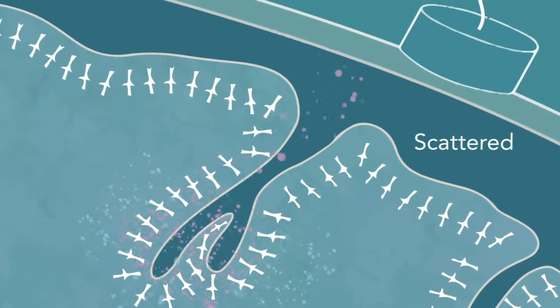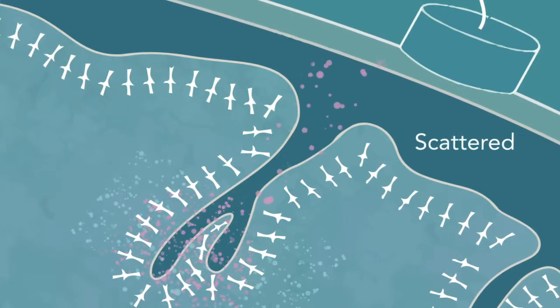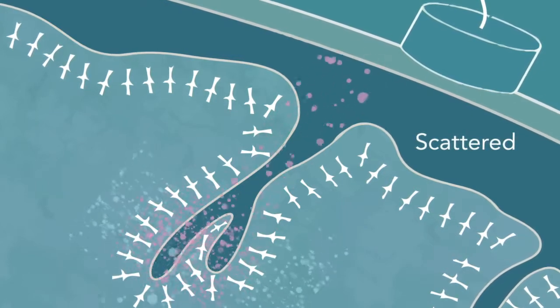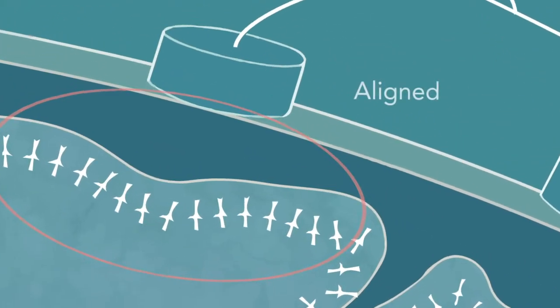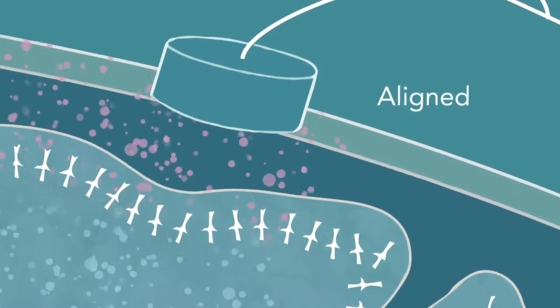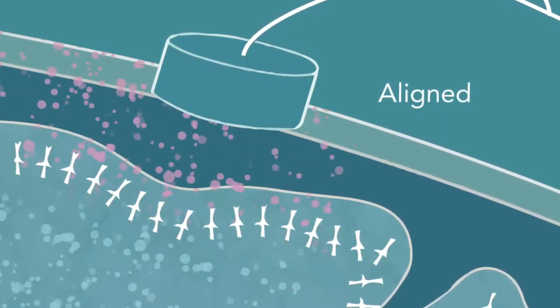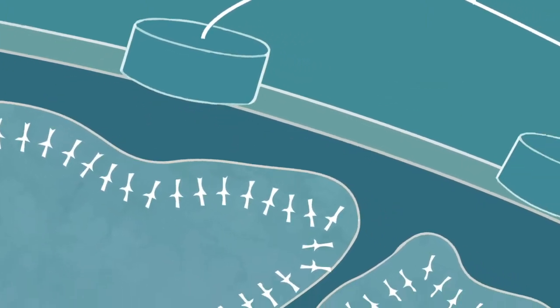Some of the signal is neutralized, but some is able to reach the scalp. Thus, varied dipole alignment only produces a weak signal. The strongest signal is generated when neurons are aligned in the same orientation. Here you can see how the dipole charges are able to sum together, generating a more powerful EEG signal.